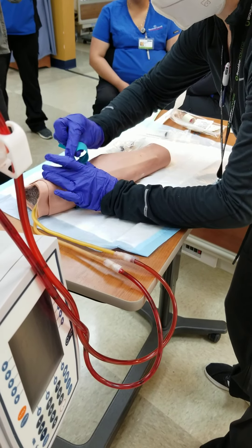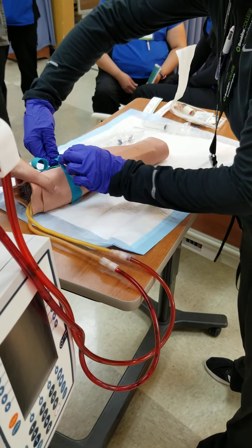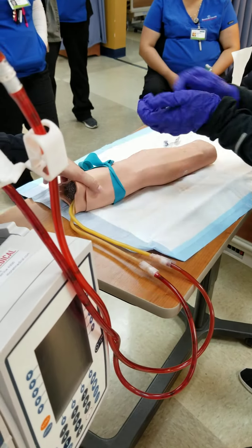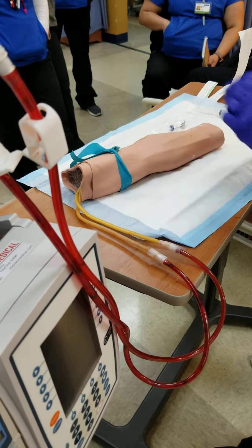You kind of have to — can you hold this down? Thank you. One goes over the top, it tucks down underneath like this. And then these appear like this. So if you're going to say you're not ready, just tuck it in and move it.